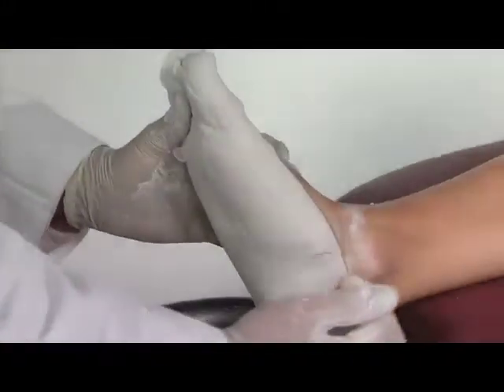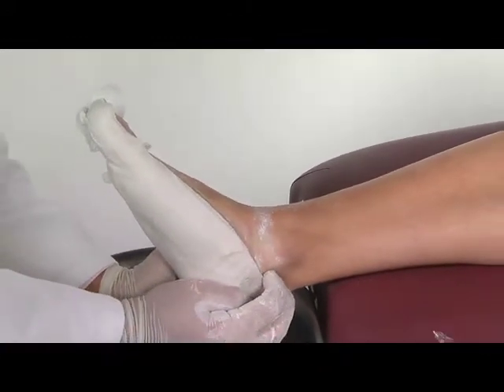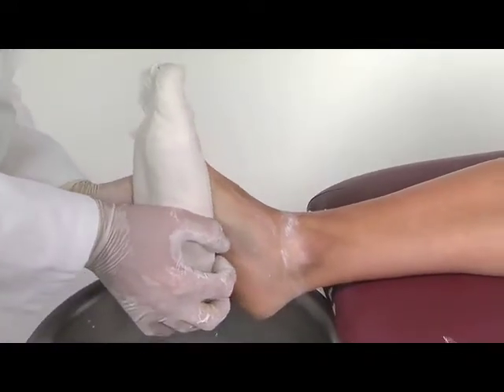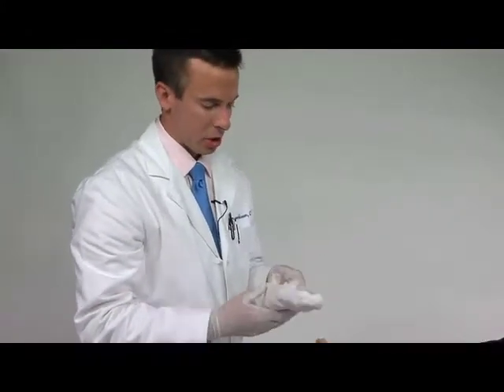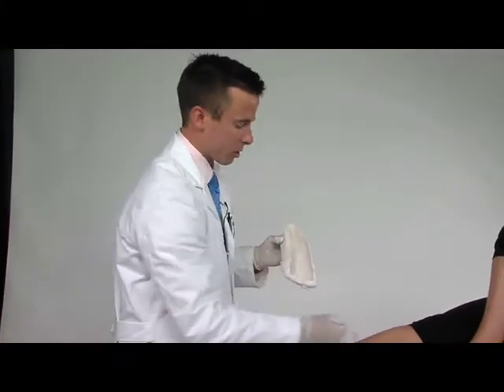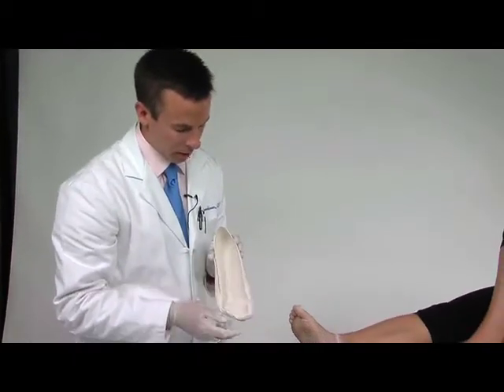Grasp the heel of the cast and pop the heel off, then slowly remove the slipper cast — and here we have a perfect slipper cast ready to be shipped to the laboratory for the fabrication of custom foot orthotics. Remove the gauze, and this is a great cast — you can see the little footprints that we have here.